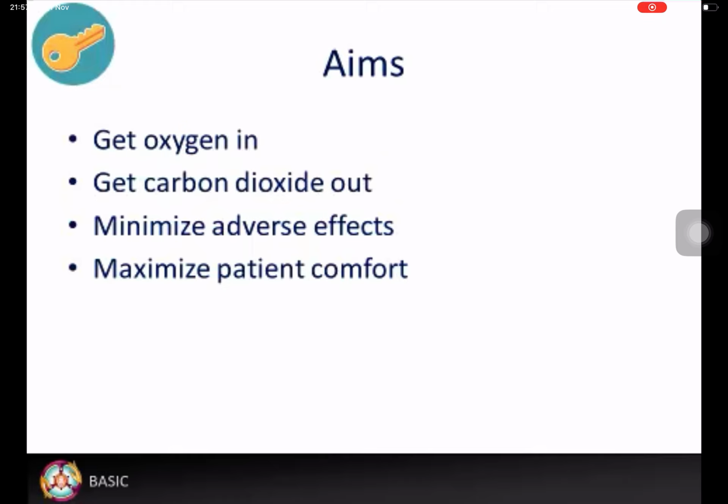The aims of mechanical ventilation are to get oxygen in and carbon dioxide out while minimizing adverse effects and maximizing patient comfort.